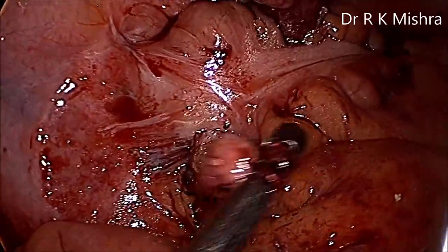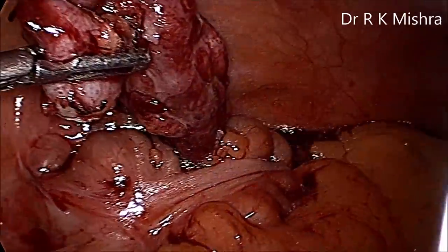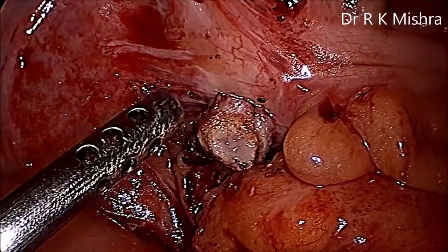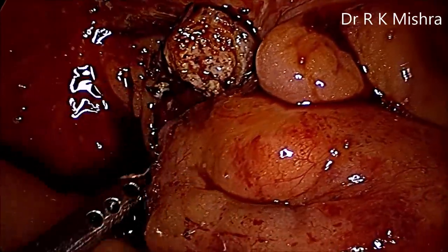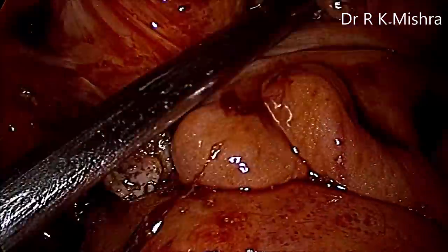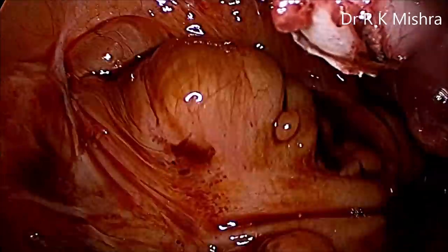And you can do suction irrigation. After that, we will put some betadine. This is the appendix which is out. We can put 5 ml of betadine over the fossa. Betadine will be injected, and then again sucked out, so that any remaining inflammation or infection will be taken care of. But we don't leave the betadine there. It should be sucked out completely.